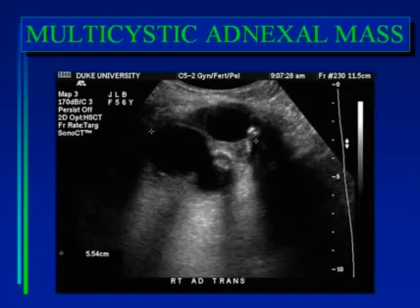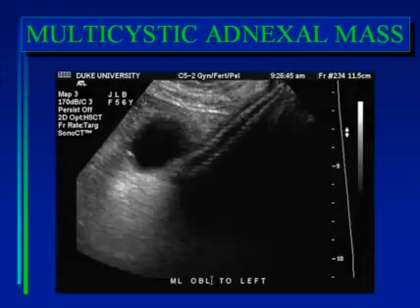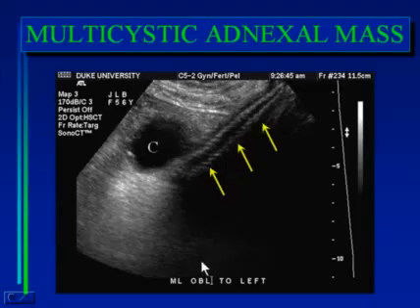This next case was another interesting example of the phenomenon of a vascular mass or a vascular structure simulating a multicystic ovarian mass. This lesion here was thought initially to be a lesion in the ovary, and you can see it's already being measured. However, when you look in different scan planes, in addition to the cystic component, you see this elongated, unusually appearing structure that looks almost like a fetal spine at grayscale ultrasound. But this patient's not pregnant, so this can't be the fetal spine.